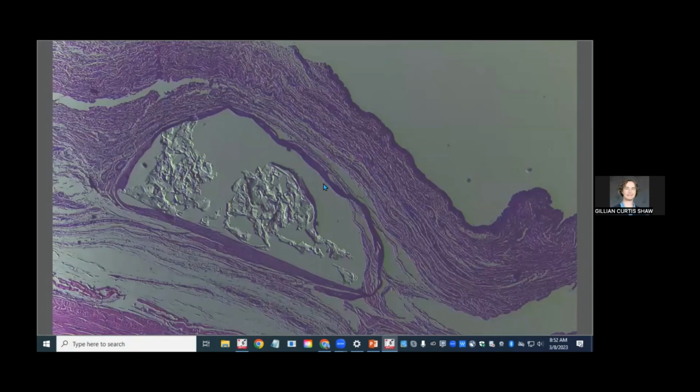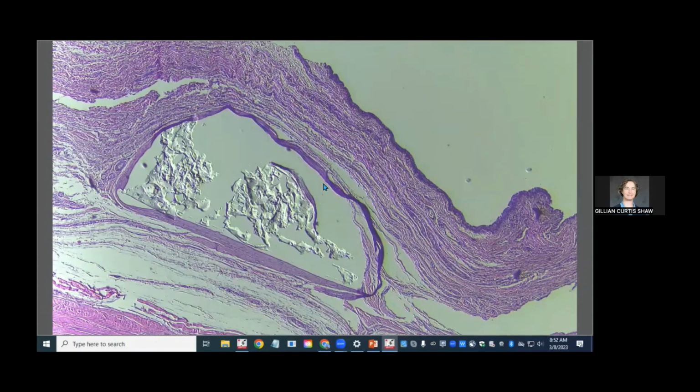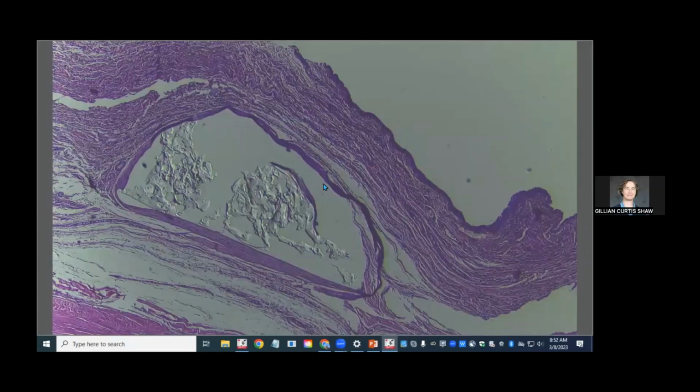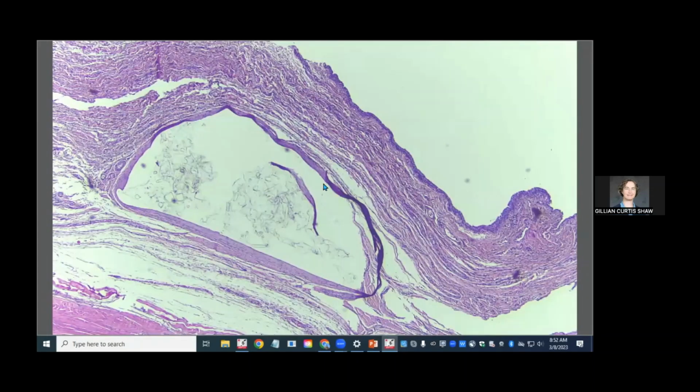If I use digital polarization here, aka I'm using my finger, you can really see the material there. That is basically the cyclosporin implant all folded up. So that's kind of neat. This slight fibrotic reaction around it is similar to what we'll often see lining the blebs of gonio implants, and presumably part of the reason why a lot of those implants will eventually need revisions of their blebs, like taking the roof off of them, because they develop this interesting fibrotic reaction. So I just thought that was neat.